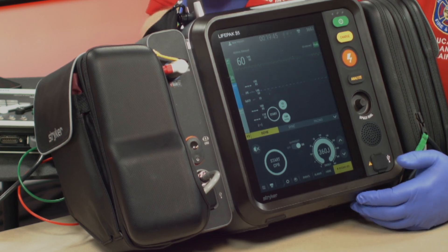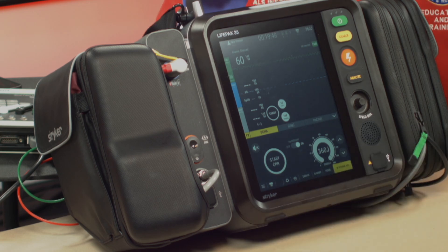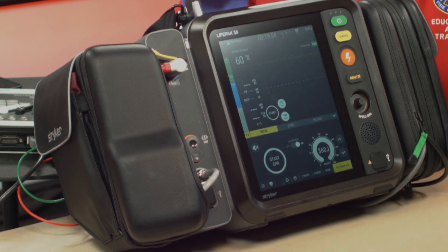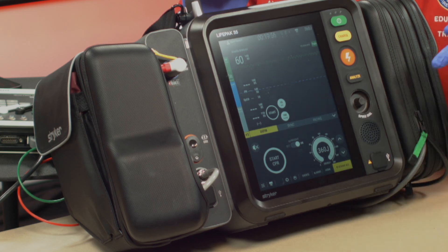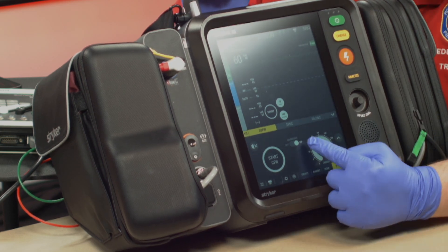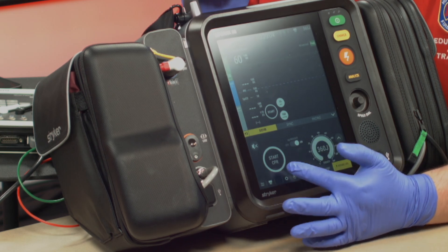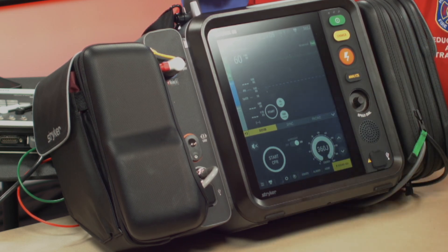A couple of things to keep in mind here. First, you'll see the Start CPR button. If you press that button, it is going to start your timer. It would also start your metronome and ventilation reminder, but you can turn that feature off by pressing the mute button. You do want to press Start CPR so that you get a reminder every two minutes when it is time to rotate, when it's time to do your rhythm analysis, etc.